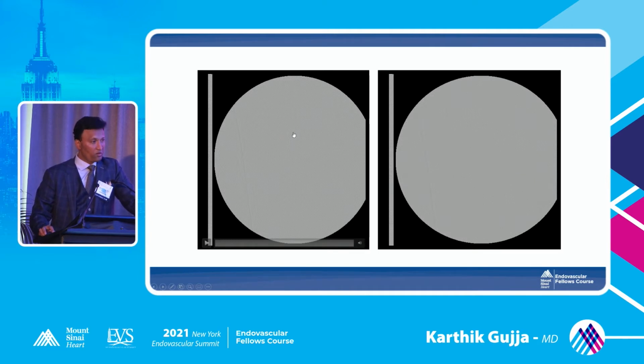So we cross luminal to luminal. Then we atherectomized it. You have 1 vessel runoff, so you have to put a filter. Even if you're atherectomizing, definitely put a filter. If it's calcified, definitely put a filter, even if you're ballooning it, because the risk of embolization is there even if you balloon a lesion. So I would put a filter, especially if it's 1 vessel runoff. That's the goal.